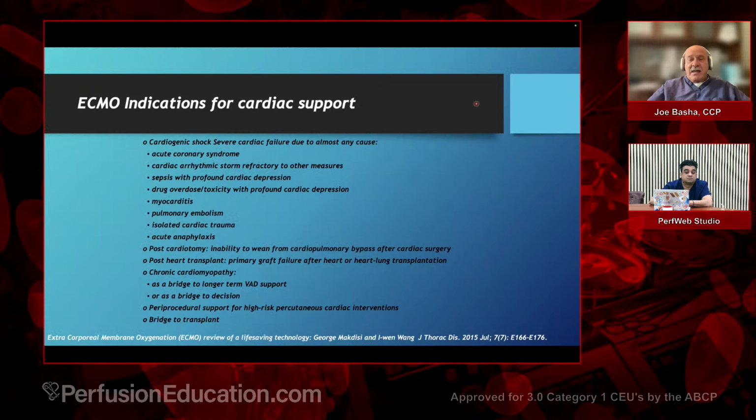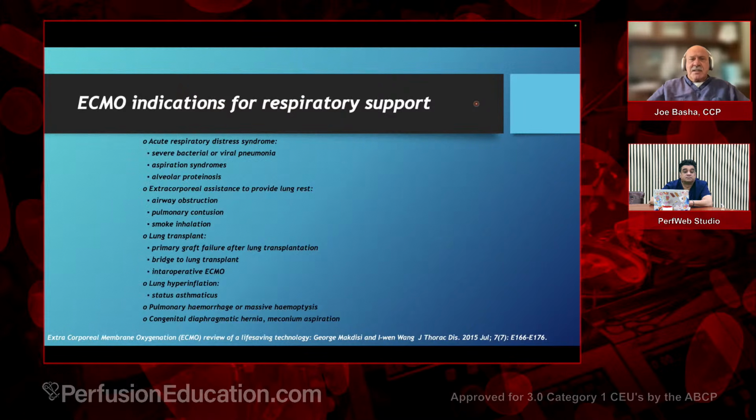We're using it for that, and we're also using it for doing keyhole incision, single LIMA to the LAD, where the patient needs some additional circulatory support to do the anastomosis carefully. When you occlude that LAD, if it's not 100% occluded, and now all of a sudden they're starting to have EKG changes and hemodynamic instability, and then of course bridge to transplant. So there's a lot of opportunities to use this.